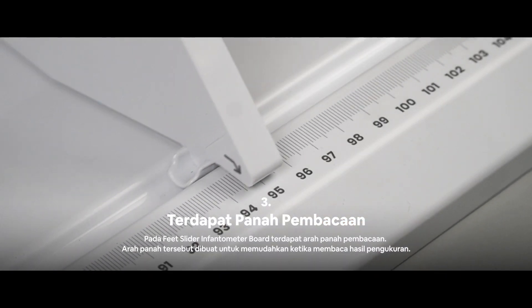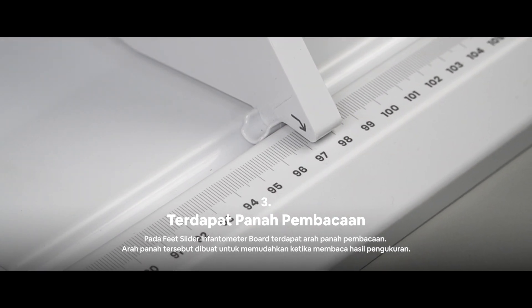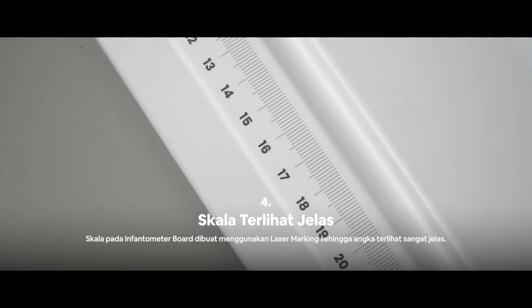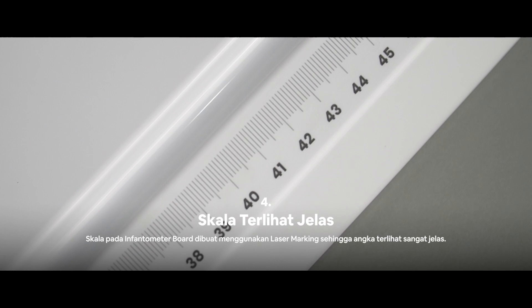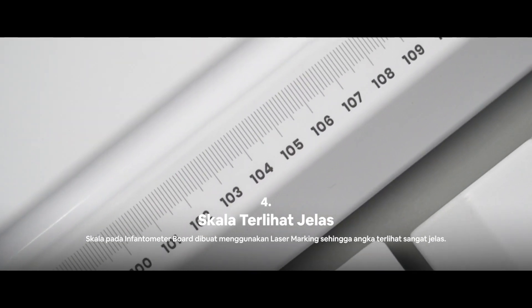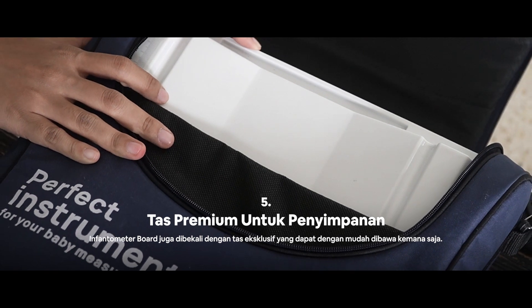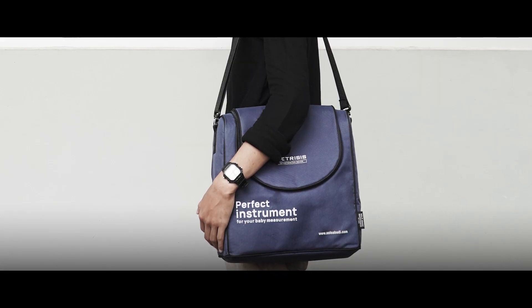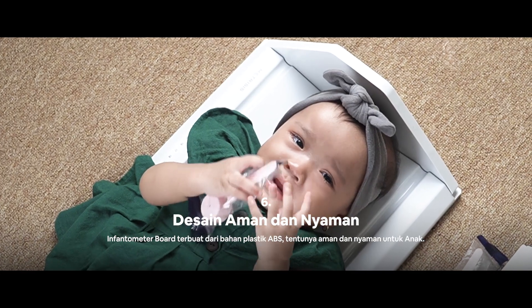There is an arrow reader that makes it easier for users to use the Inventometer board. The measurement scale is made in detail using a laser marking system. It also comes with the most exclusive and premium storage pack, and is designed to be safe and comfortable for babies.